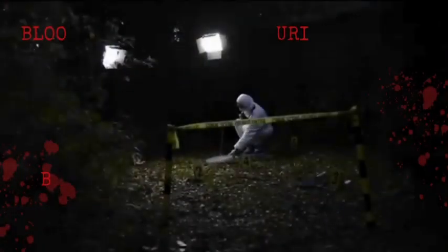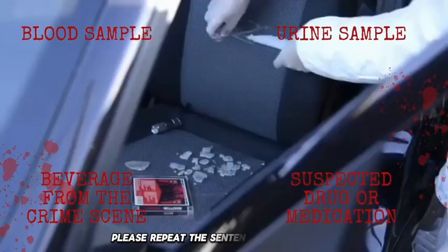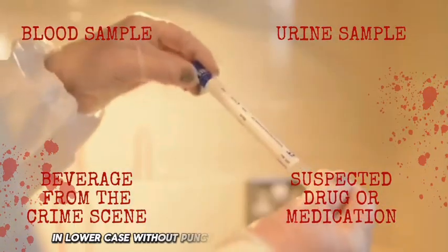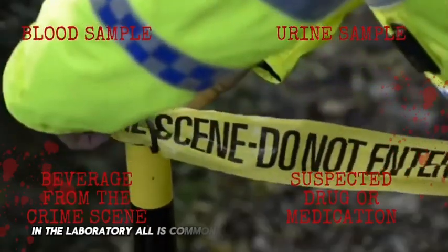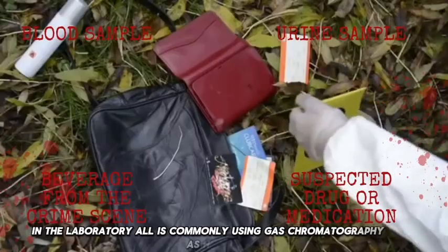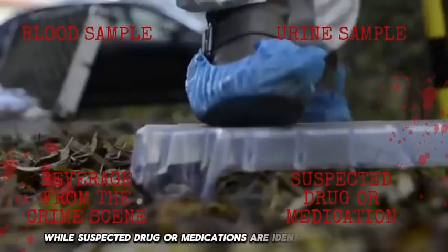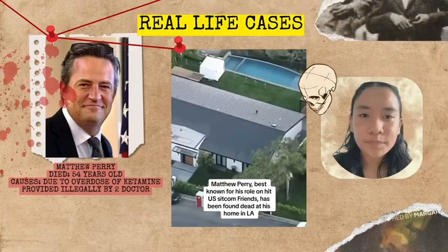Beverages collected at a crime scene can provide important forensic evidence because they may contain alcohol, medications, or illegal drugs. Investigators collect and seal the drinks carefully to preserve their integrity. In the laboratory, alcohol is commonly analyzed using headspace gas chromatography (HS-GC-FID), while suspected drugs or medications are identified using GCMS or LCMS.